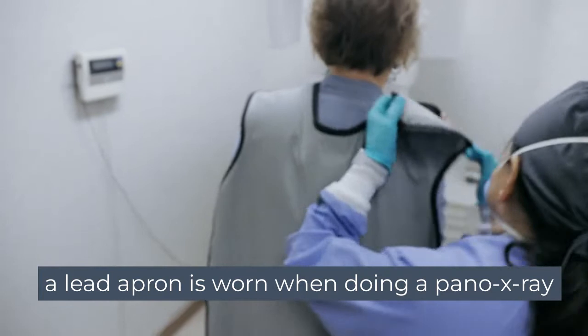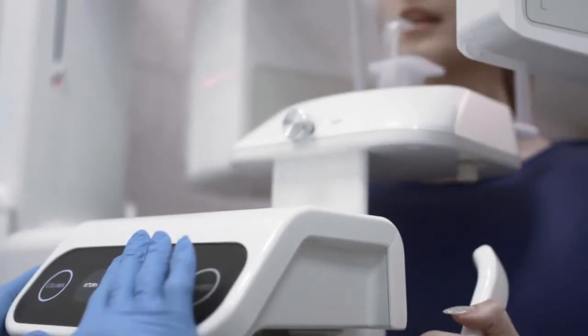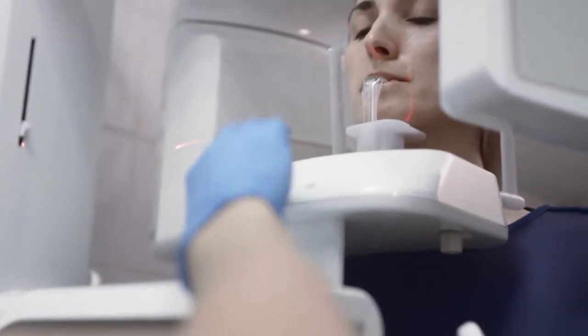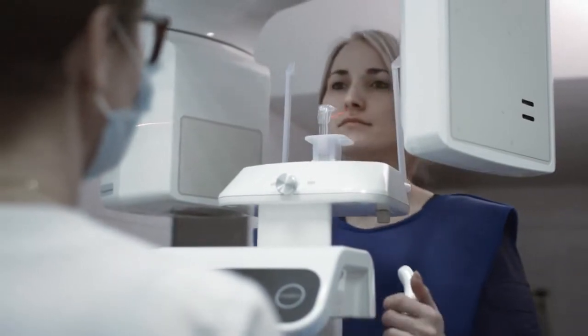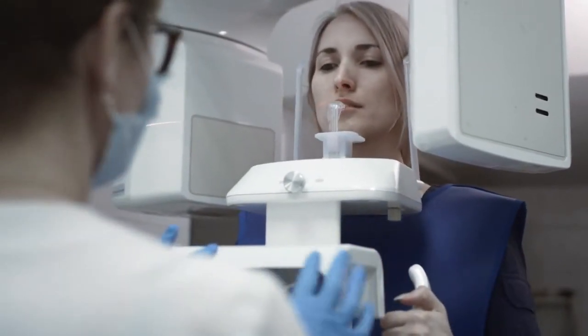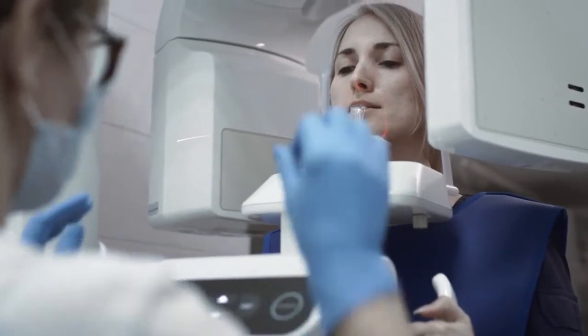Next, the dental technician may place a lead apron on you and have you walk into the dental imaging scanner. The dental imaging tech will fix the height of the machine according to your height. You can comfortably bite down on a little stick, and they will explain to you where they want your teeth according to the type of stick.